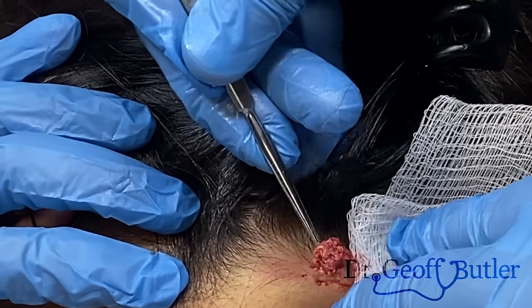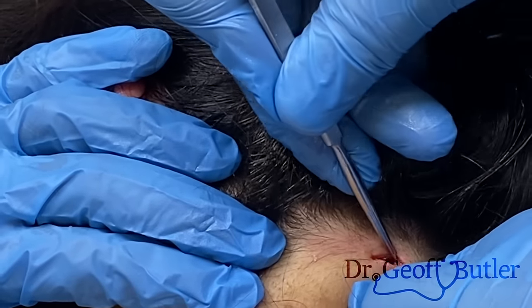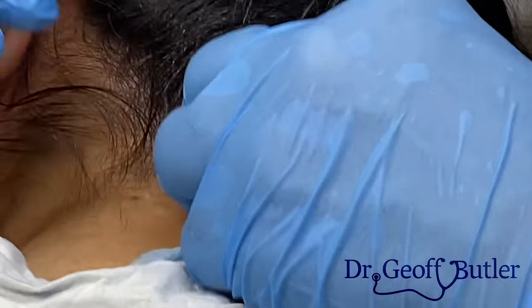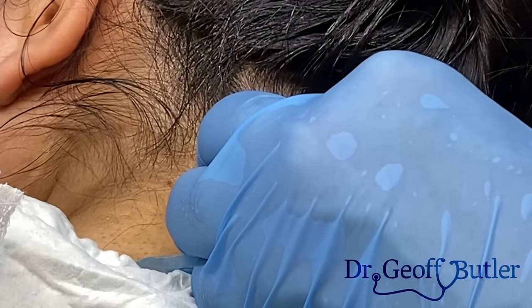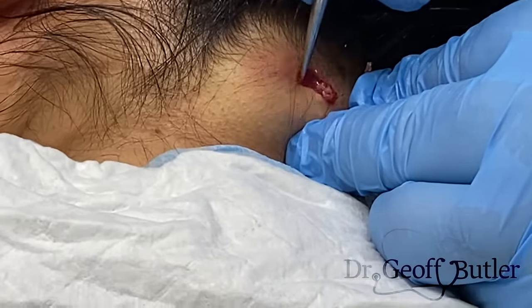You can see when you break down a loculation, like you open up. Is that hurting? Yeah. I'll see if I can add a little more freezing to there and see if that works a bit better. So this is always a limitation when you're trying to do more aggressive breakdowns. It'll poke in here. So now the capsule is broken down, so we're not distending the capsule anymore. So I can see if I can freeze in behind it. Is that hurting as much when I do that? No.